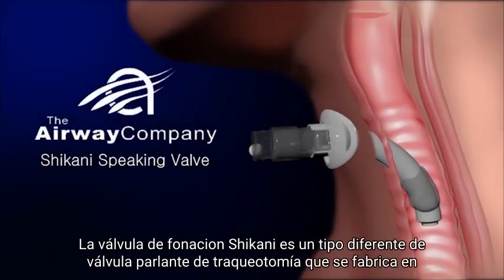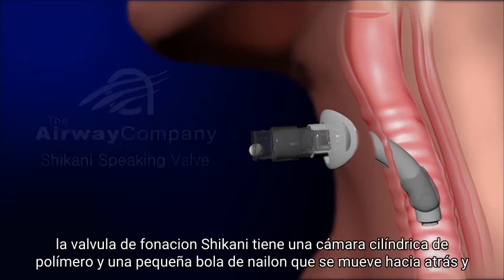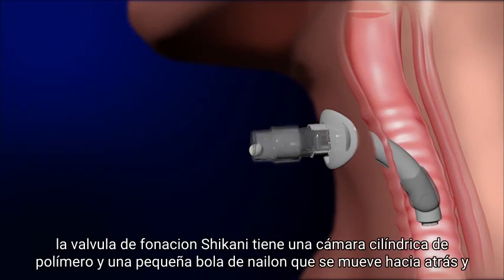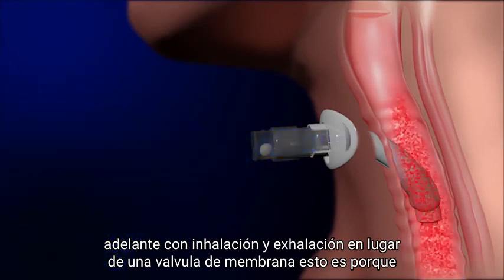The Shikani speaking valve is a different type of tracheotomy speaking valve which is manufactured in the United States of America by the Airway Company. The Shikani speaking valve has a polymer cylindrical chamber and a small nylon ball that moves back and forth with inhalation and exhalation rather than the flapper membrane.